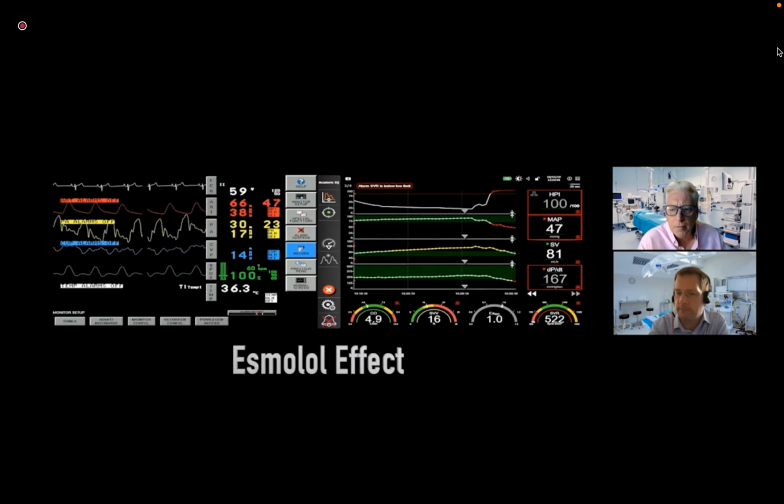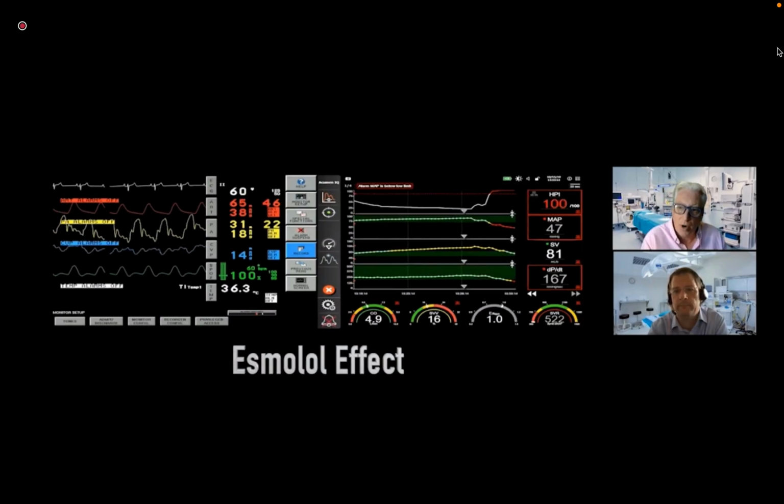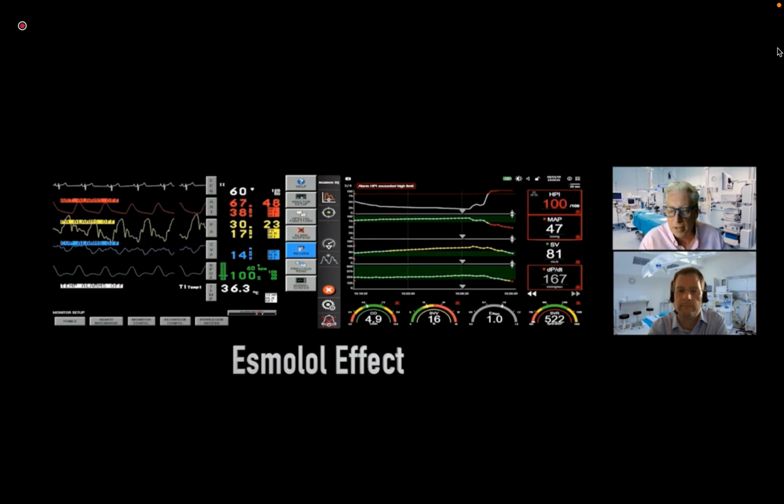And as we've given that negative inotrope, we're seeing our DP/DT start to decrease and our stroke volume also start to decrease as well. So if you're looking at this and trying to make a decision about a therapeutic intervention, as you have had a drop in DP/DT and hypotension and everything else that goes with it, the primary intervention would be to try and improve your DP/DT by giving an inotrope of some sort. Very much so. So when we go through our pathways to try and determine which the correct intervention is, one of the things we'll look at is our contractility.